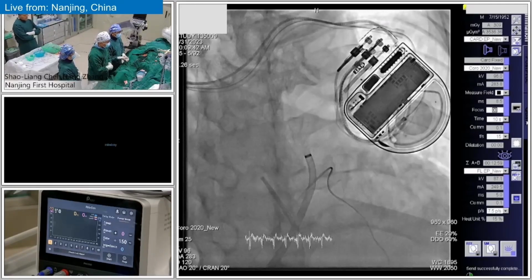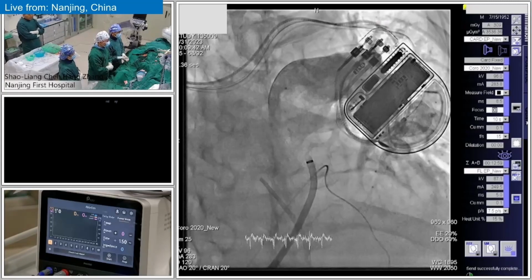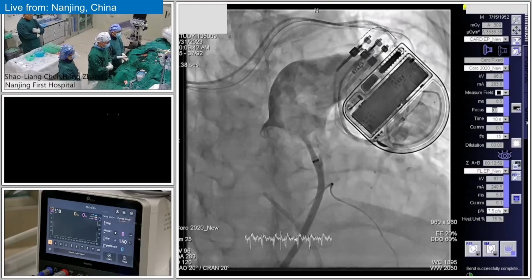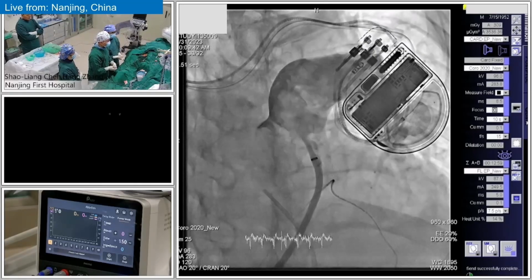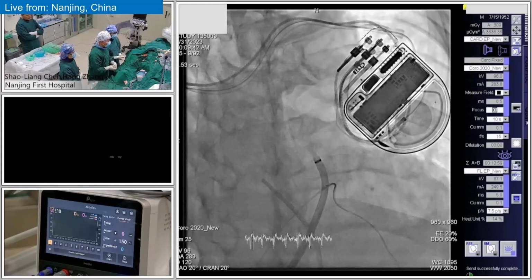According to our animal study and autopsy, the sympathetic nerves of the main trunk of the pulmonary artery are localized at the left lateral wall, a neural hub on the left lateral wall of the main trunk of the pulmonary artery.